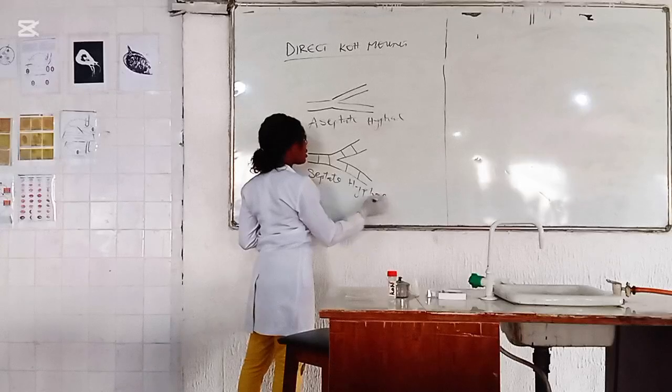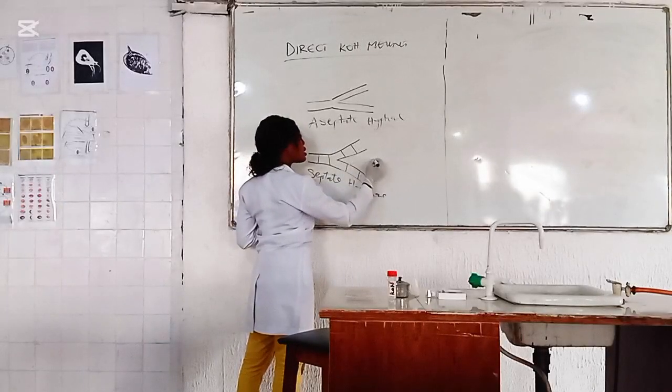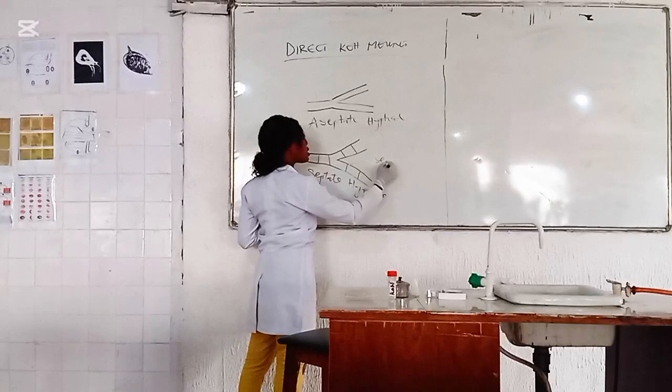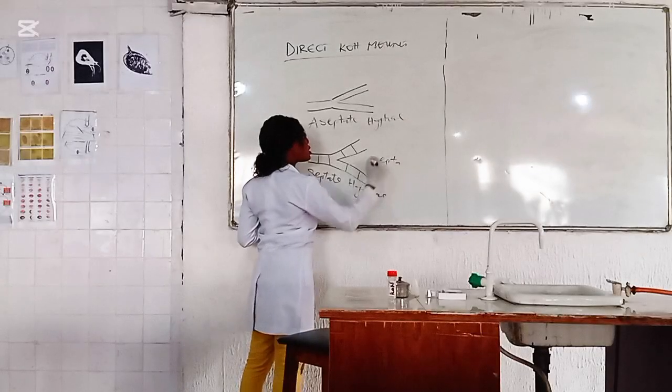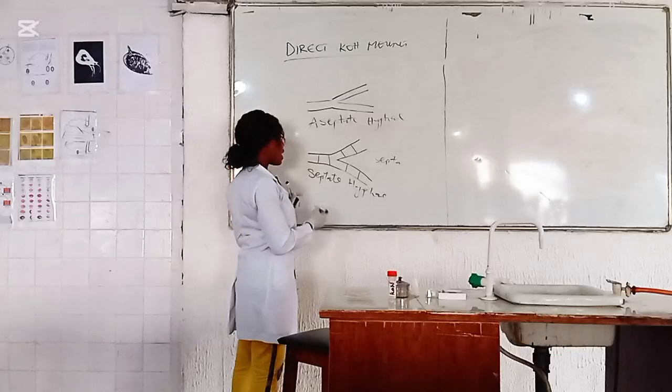Septate hyphae. Now, these are the septa.